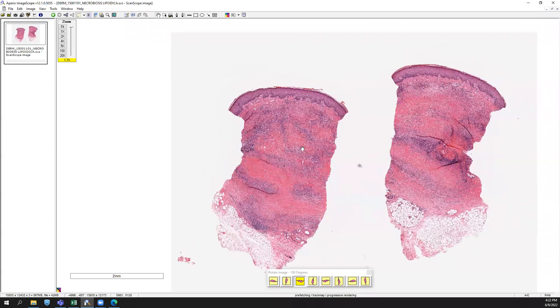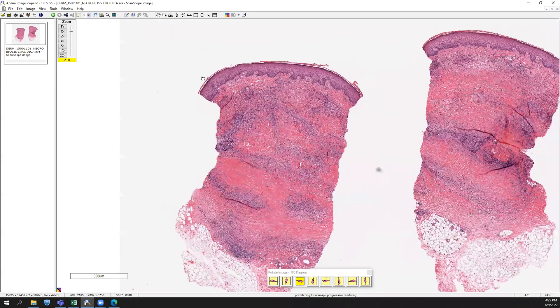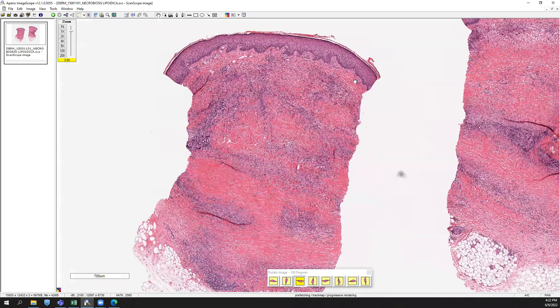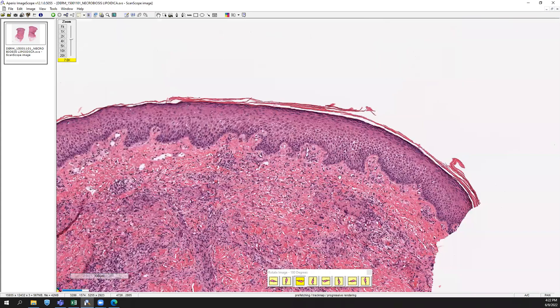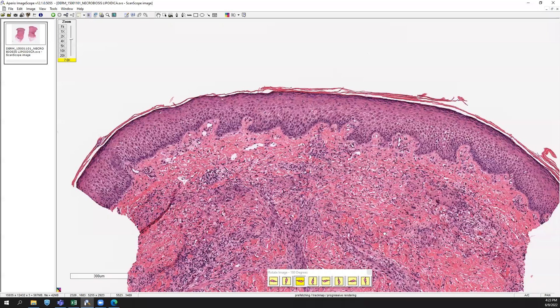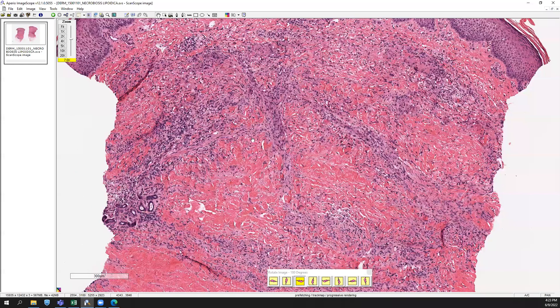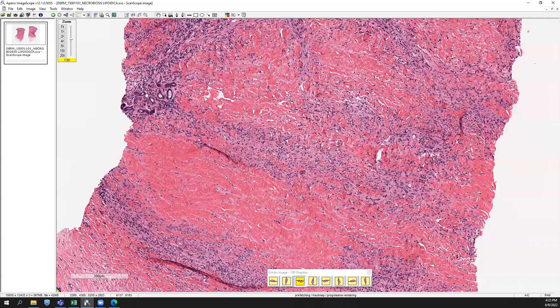Here is a punch biopsy, and you can see a superficial, mid, and deep inflammatory infiltrate. The overlying epidermis looks mildly spongiotic, maybe a little bit of acanthosis as well, but the primary pathology here is really the changes in the dermis. You can see this kind of layered lymphohistiocytic appearance.